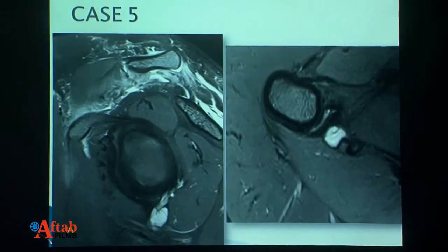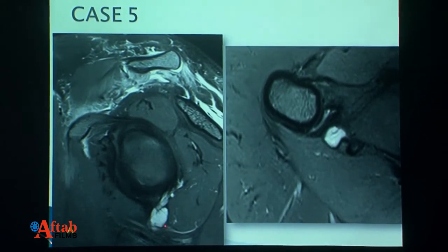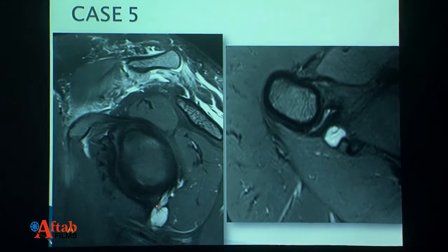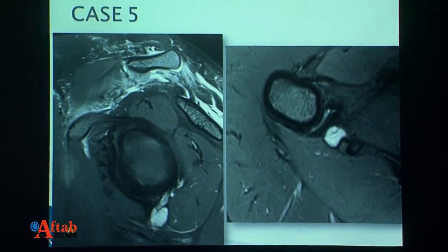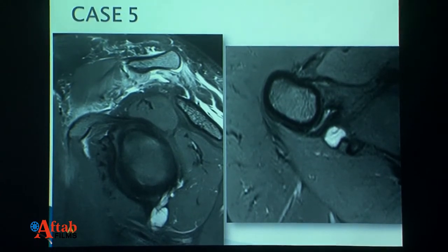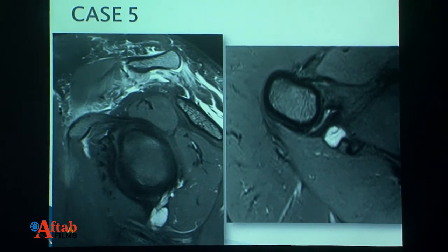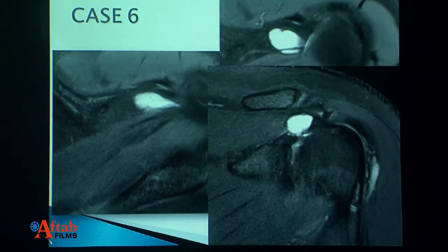This is a large paralabral cyst at the six o'clock position, with the probable tear at five o'clock. The presence of this cyst can cause compression, and compression can cause suprascapular nerve compression. Therefore, the most important thing is not only to look for the cyst but also to look for any denervation edema in the muscles. Your report impression should mention whether there is evidence of denervation edema.